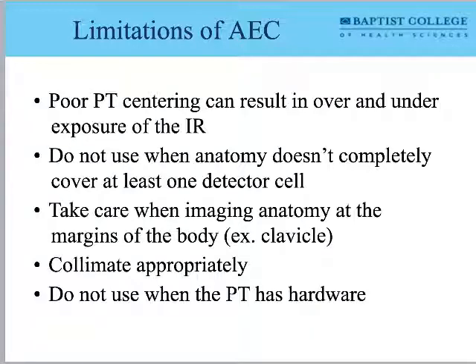Even if the AEC is used properly, make sure that it's representative of the anatomy of interest and ideally the tissue of interest, right? And he talks about that distinction on number 3.